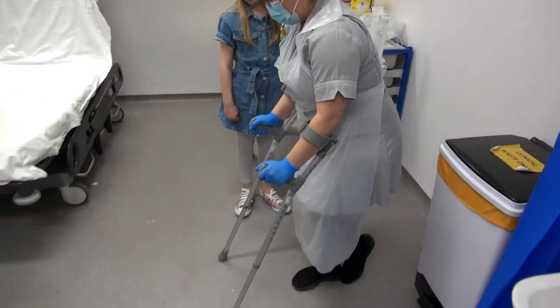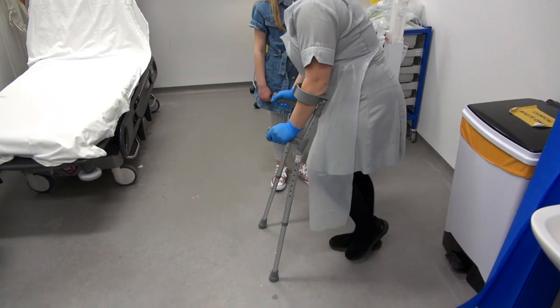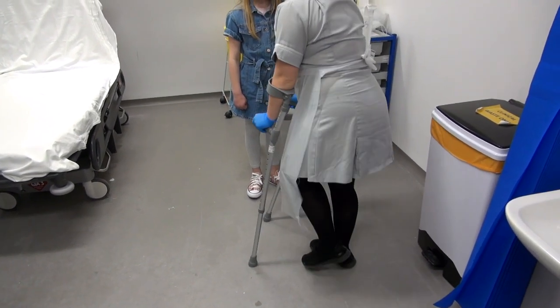When you're twizzling, just take your time — just little twizzles on your good leg, just little baby steps around.